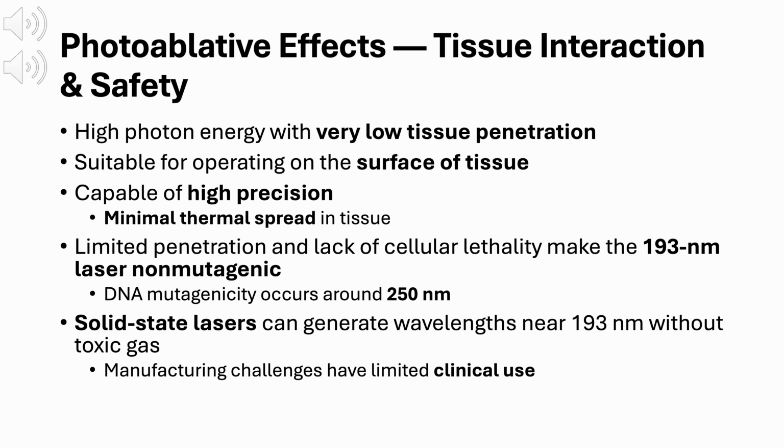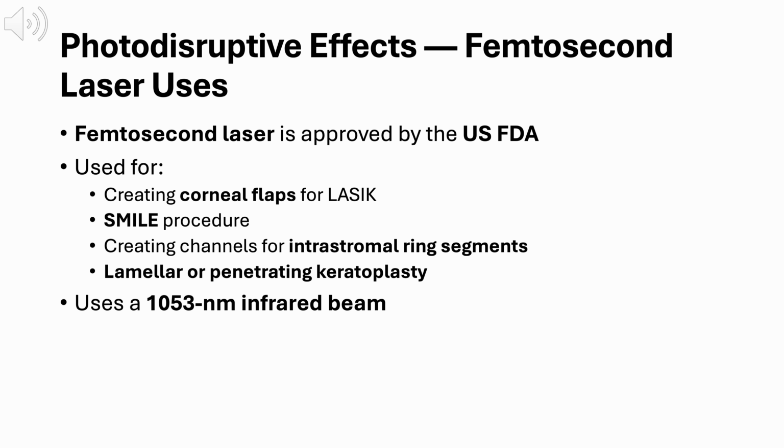Finally, it's worth noting that solid-state lasers are capable of generating wavelengths near 193 nanometers without the need for toxic gases like fluorine. However, significant manufacturing and engineering challenges have limited their widespread clinical adoption so far. Taken together, these properties explain why excimer photoablation remains uniquely suited for corneal reshaping. It is precise, predictable, and biologically well tolerated.